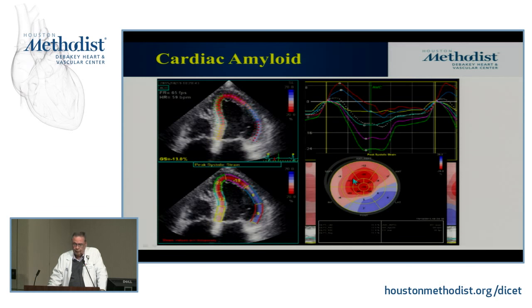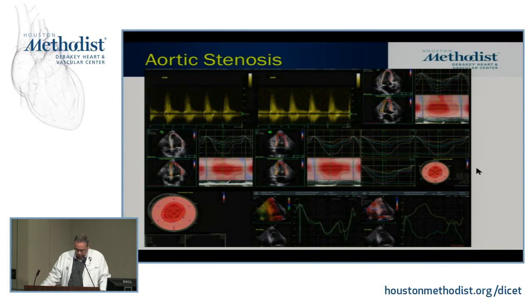But this particular picture here is from a biopsy-proven amyloid patient. However, look at this. This one is gorgeous, beautiful. Patient with aortic stenosis. So I can show you some ASs, I can show you some end-stage renals. We have them in the file. So this is not the final wonderful diagnostic proof. It's just one more thing. If you see it together with everything else, hey, think of it.